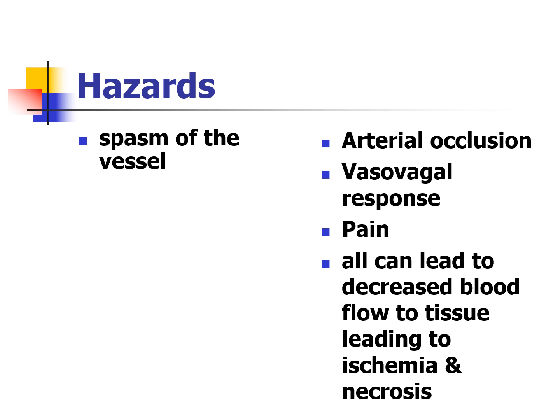And also when it's constricted, when the artery is constricted, that means the wall of the vessel is now thicker, because remember, all those things move closer together when it constricts. And so now it's harder to pass the needle in through the wall of the artery and into the bloodstream itself. So it makes for a very hard stick. So the more nervous or anxious a patient is about the procedure, the less likely your chances are of getting it because of that spasm.